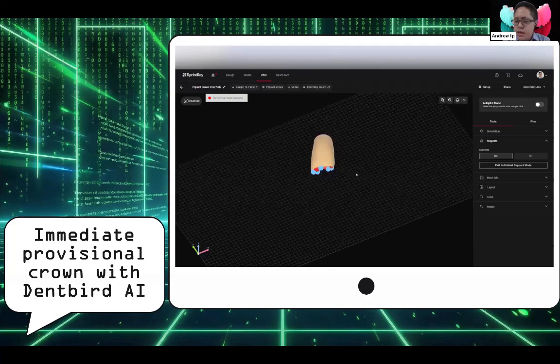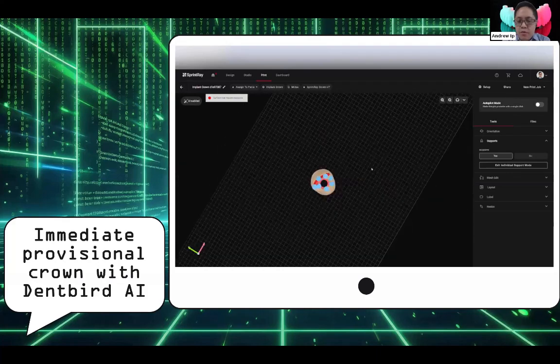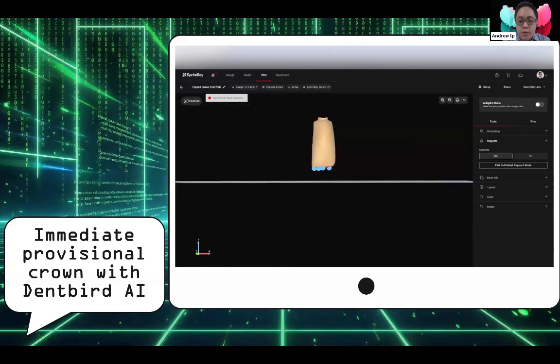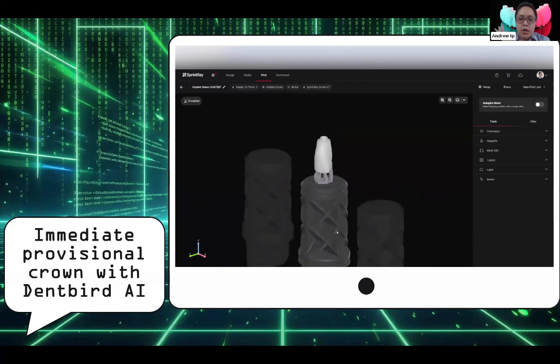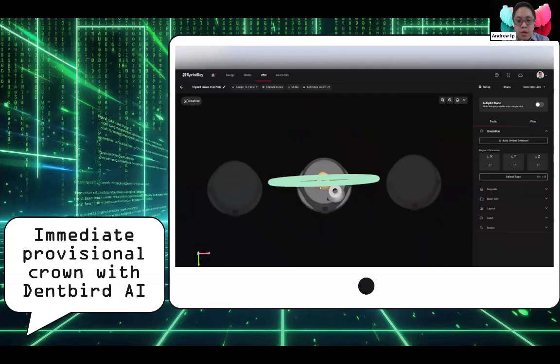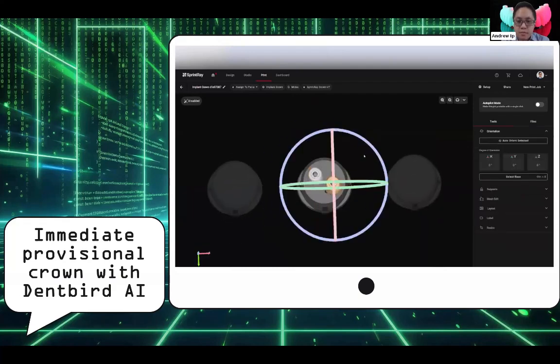I think it's 60% filled with ceramic filler content. And yeah, it's a really nice material. It polishes up beautifully, which is really important because, as I said, anything that contacts the soft tissue must be polished to a fine shine, and you must not glaze those particular areas.